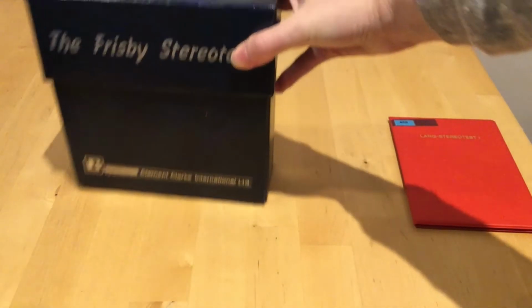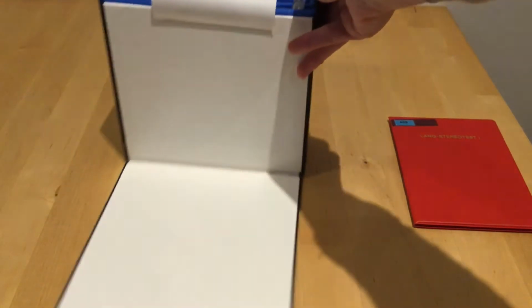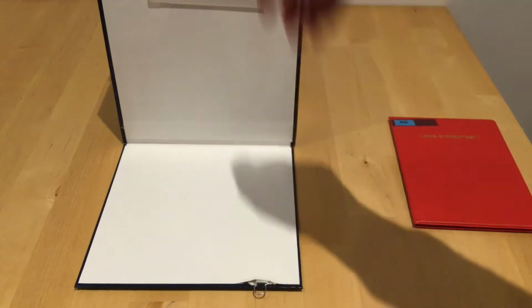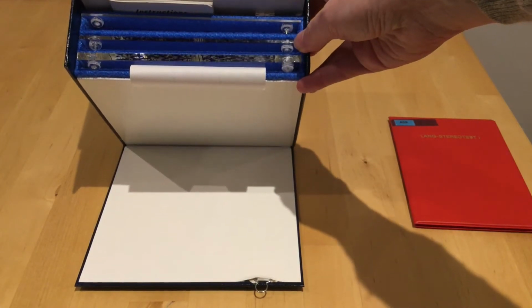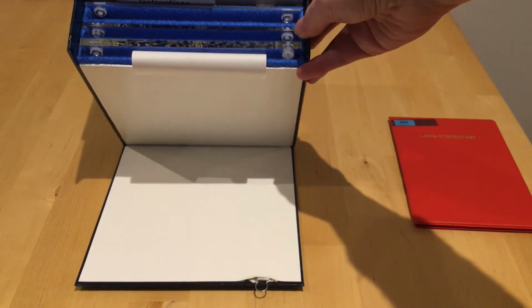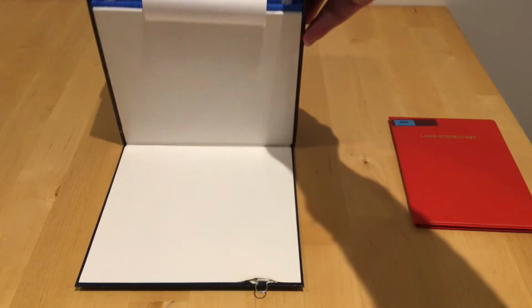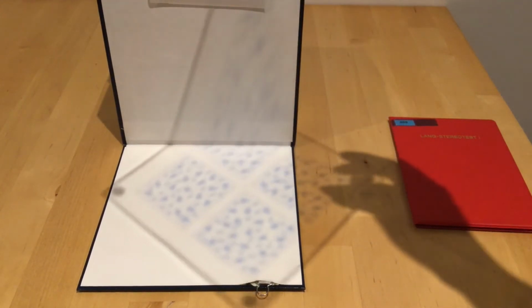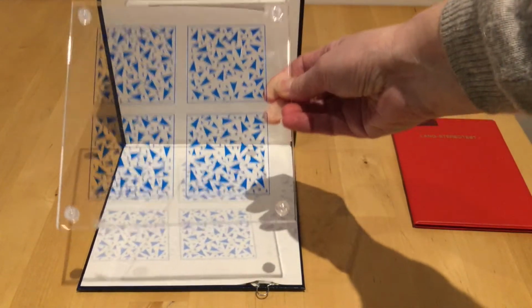Moving on now to the Frisby stereo test, and when you open the box, I've just flipped up the label here, and we need this plain white background. And in the box, if I just tilt it down, you can see that there are 3 perspex plates, and they have different thicknesses. So we always start with the thickest plate, and it doesn't matter which way around you hold it, check first.